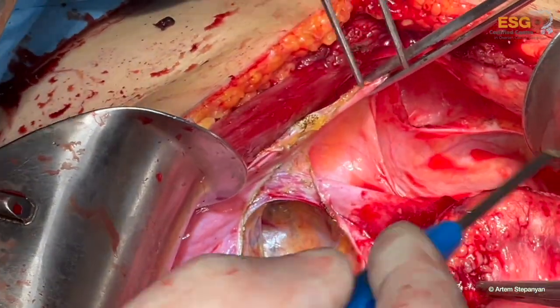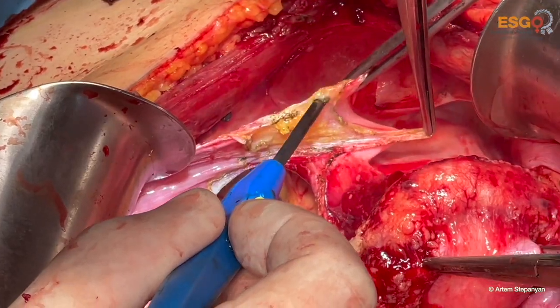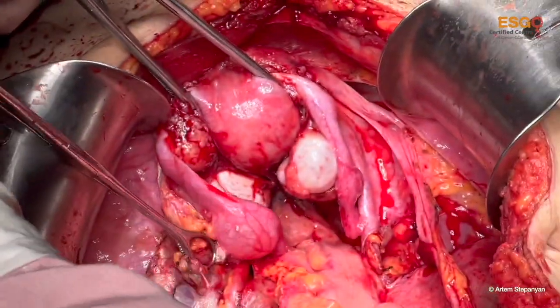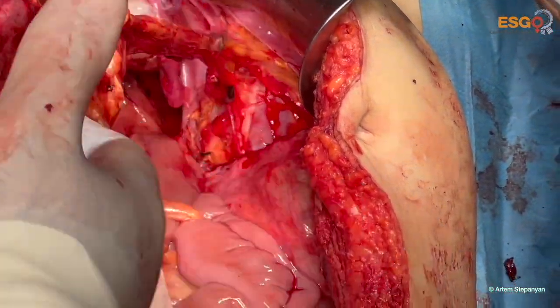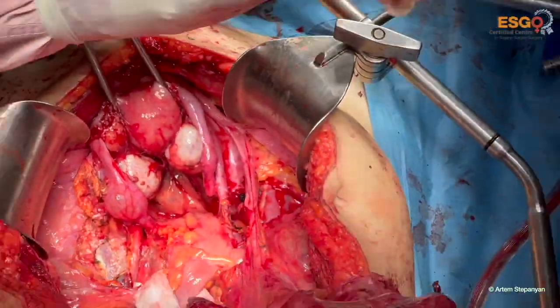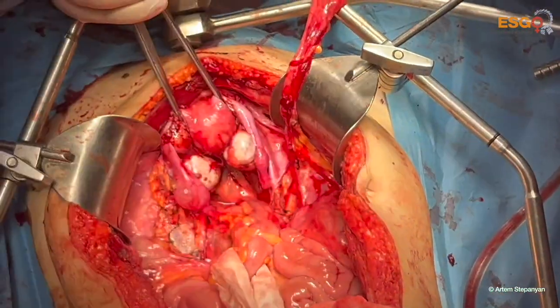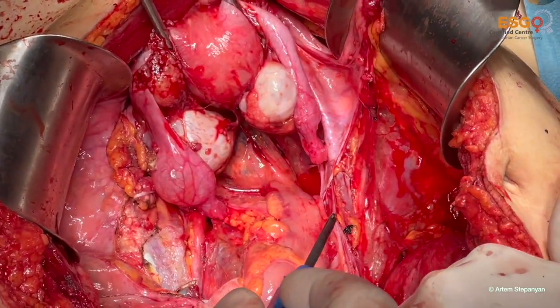So we start from the left side, detaching the left side pelvic peritoneum. Once the left side is partially done, we can move to the right side. Here you see the removed peritoneum. We exteriorize it from the operative field.